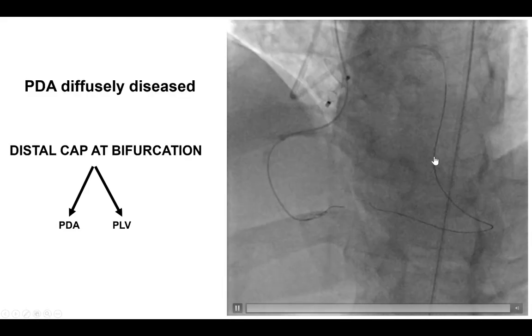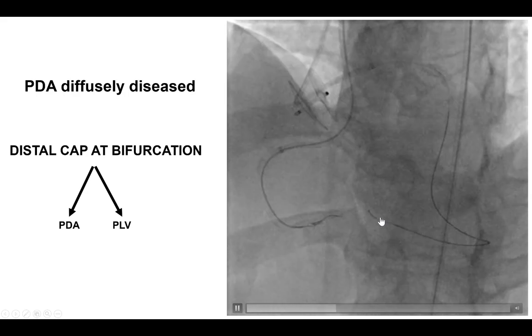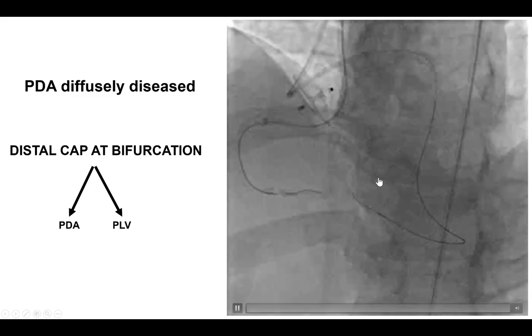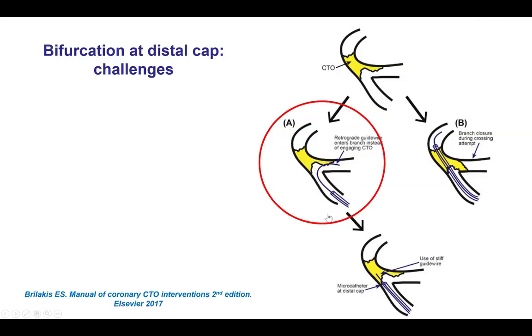However, once the Caravelle went all the way to the PDA, the retrograde guide wire kept on entering into the right posterolateral branch instead of going towards the distal right coronary artery. This is one of the common challenges with CTOs that have a bifurcation on the distal cap — the retrograde guide wire keeps on entering the side branch instead of engaging the CTO. The other potential challenge is that we get through the CTO but close the side branch during the process.